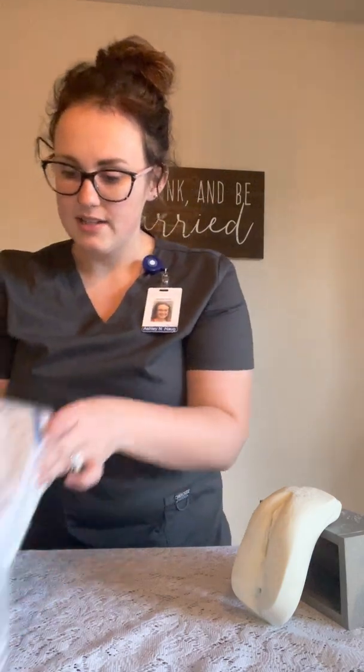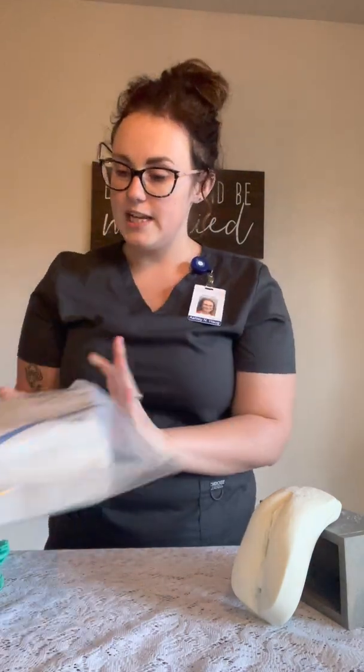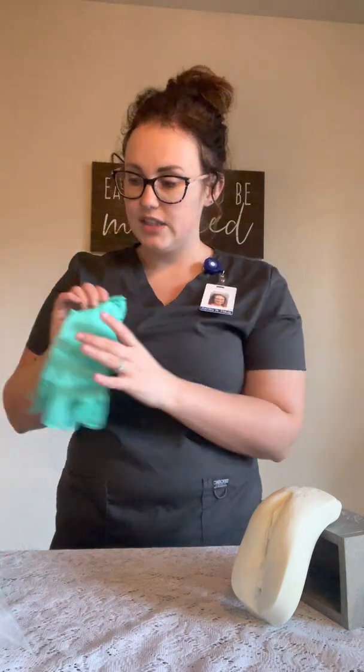So as far as supplies go, I have my Foley kit. I have a clean pair of gloves, as well as a wet washcloth with soap, non-rinse soap and water that I'm going to begin cleaning my patient with.